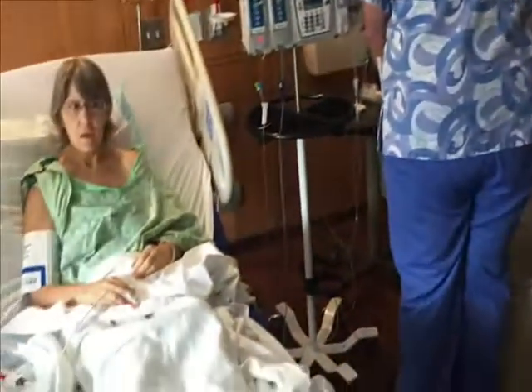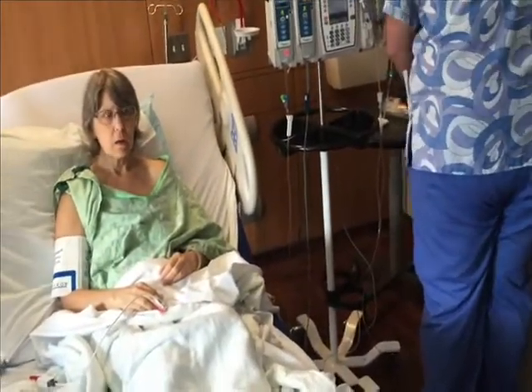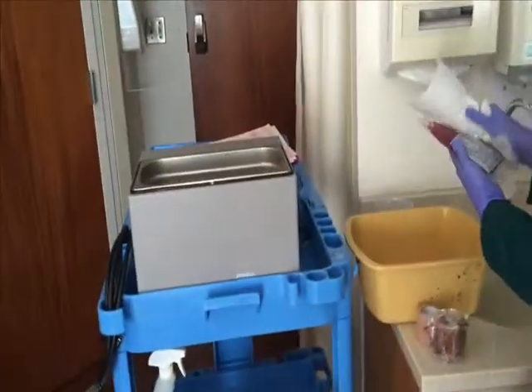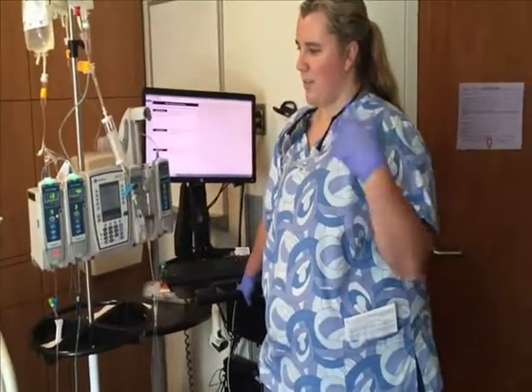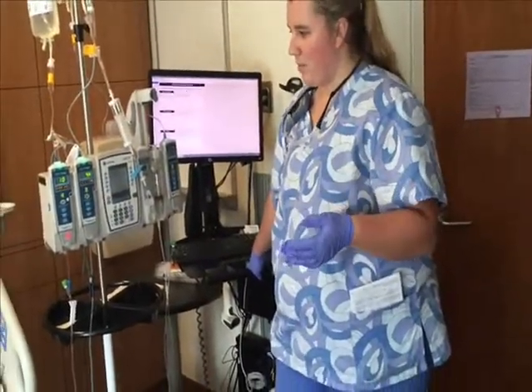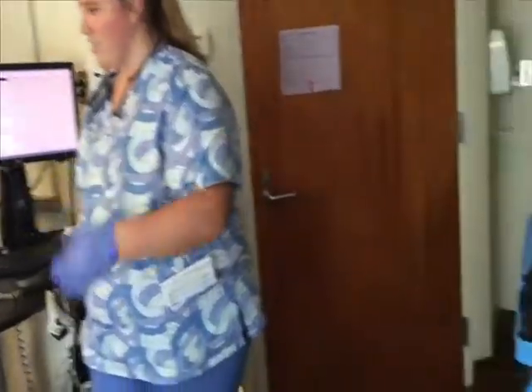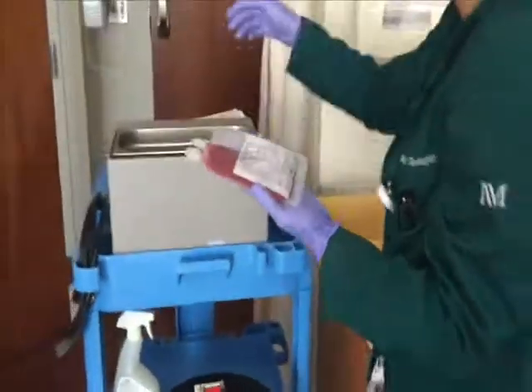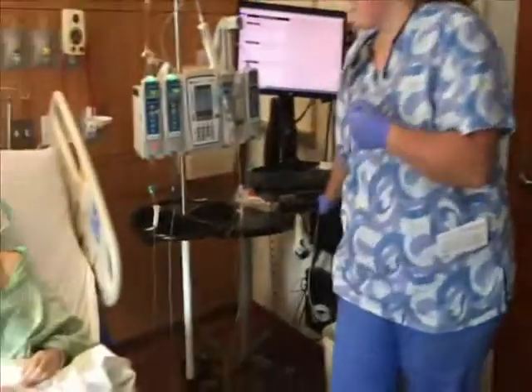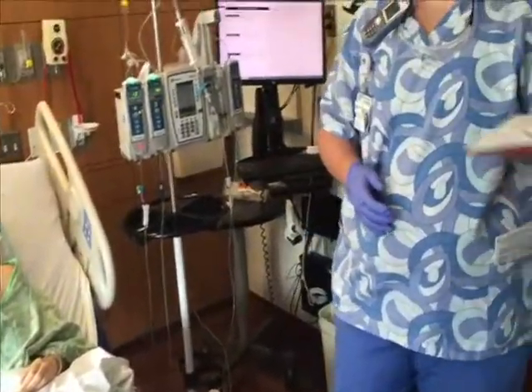Cindy, you're getting preservatives. And supposedly it smells like cream corn. I never get close enough to smell it. The preservative in the bag, the way we break it down is through our breath. So we like to keep you talking, to help break it down some more. Your breath literally starts to smell like cream corn. You may not be able to taste it or smell it, but we can. Sometimes people will walk in and say it smells really sweet in here, and that's why.